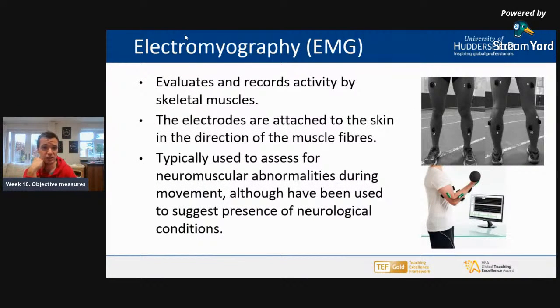And finally, electromyography, and again, this is something that I'm quite interested in, and I intend to use certainly in my research over the next couple of years, to look at muscle activity. Now, the downside straight away is it can only identify superficial muscles, which are mainly your mobilizers, the ones that are responsible for developing sort of peak forces.